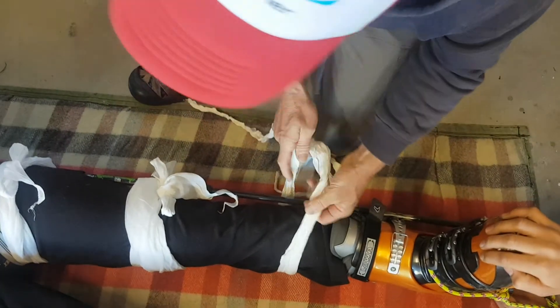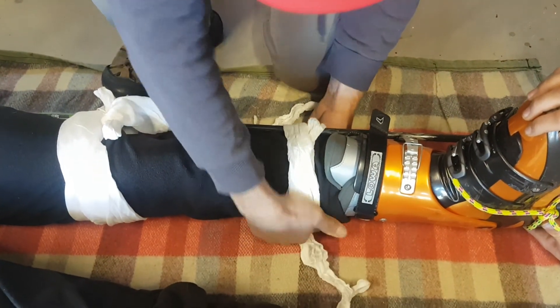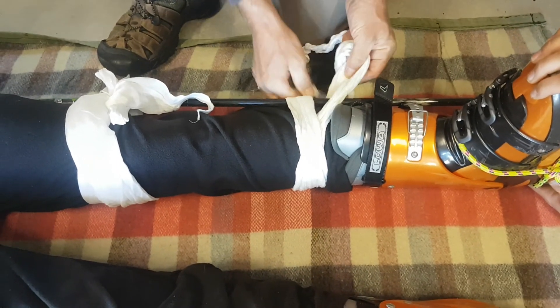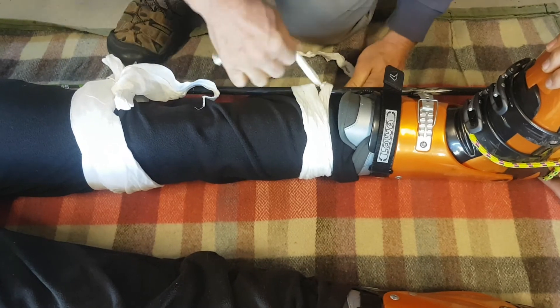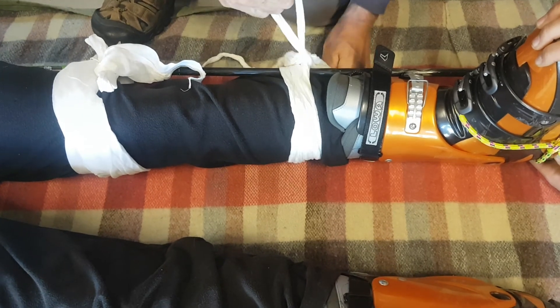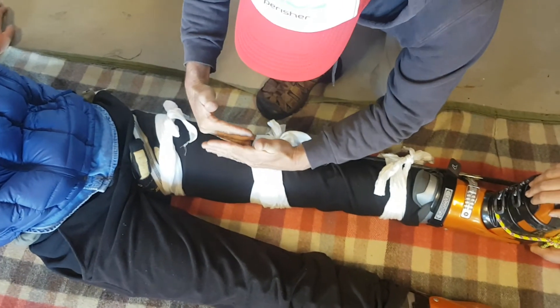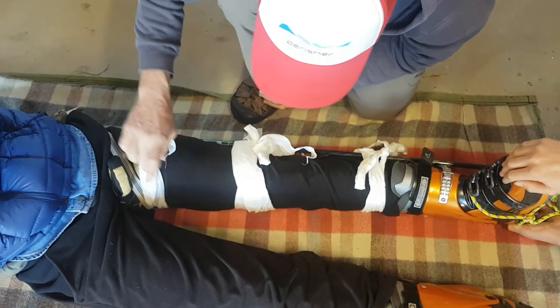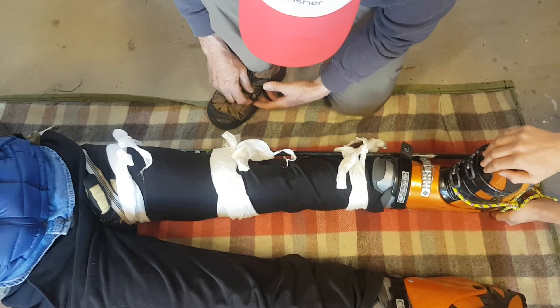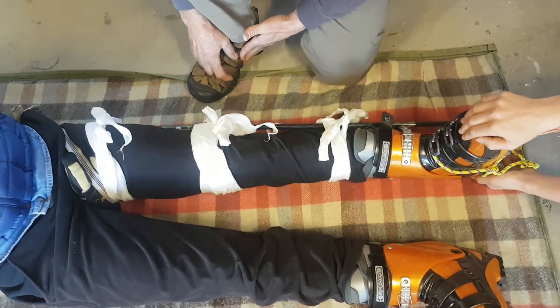Can you wiggle your toes in that boot? Any pins and needles in your toes, or does it feel okay? It feels all right. We'll take his pulse again — keep talking to him, keep him happy. Think about blood loss in that big muscle. We need to keep that tension on because if we let go, the bones can come together past each other and compromise the femoral artery, causing even more blood loss. Keep the guy comfortable and think of shock with a lot of blood loss — we need to treat him for shock also.